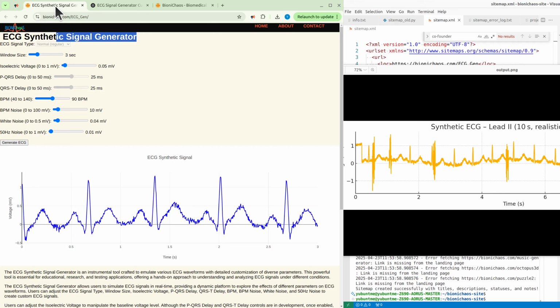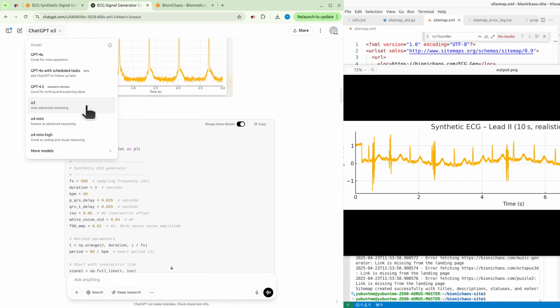So we're doing just a quick recap. We're doing the ECG synthetic signal generator. This one existed on the website. You can go check it out. I'll share the link in the chat. And someone was asking, why am I not able to adjust the PQRS delay, which is the delay between the P wave and the R peak, and the QRST, the delay at the end of the ECG waveform. This is because in this version of the simulator, it wasn't implemented yet. So it's just a placeholder.